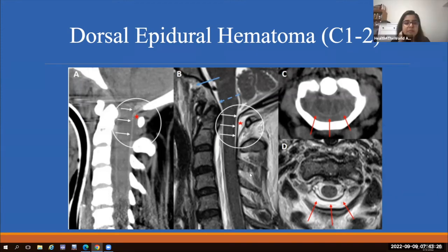Yeah, that's an excellent point. Some of the participants from our countries also heavily base their imaging on CTs because that's more common in resource limited settings. So it's a good idea to have both perspectives on how these tears and injuries look on both CT and MRI.